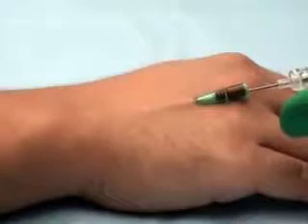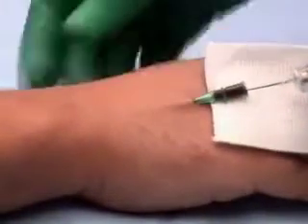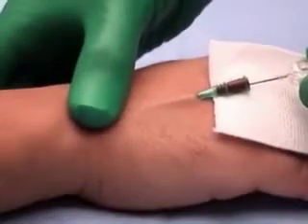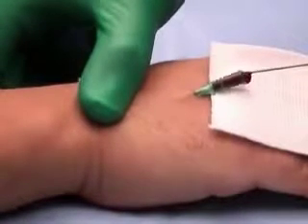When the catheter has entered the vein lumen completely, remove the tourniquet. To prevent blood loss from the open plastic cannula hub when the metal needle is removed, place direct pressure over the vein proximal to the end of the catheter, and place a gauze pad beneath the cannula hub.